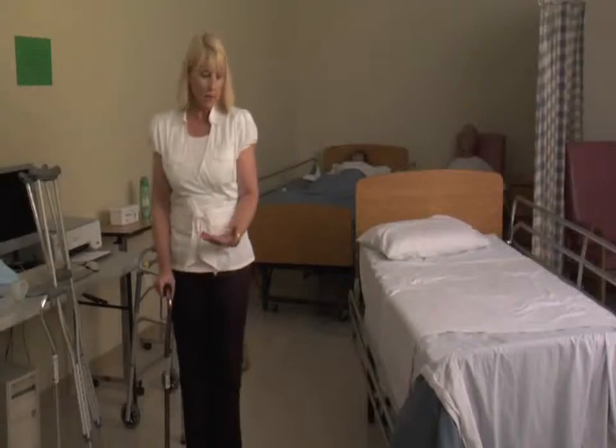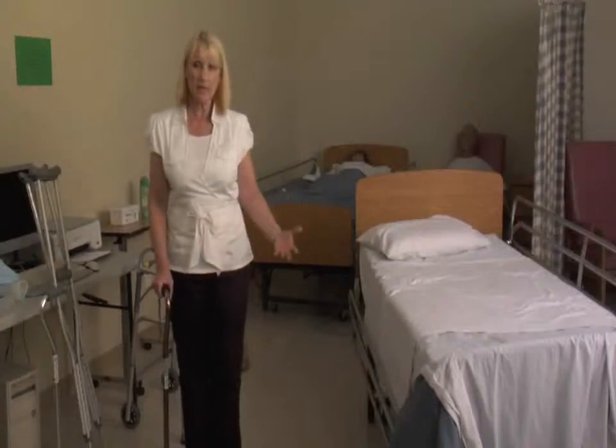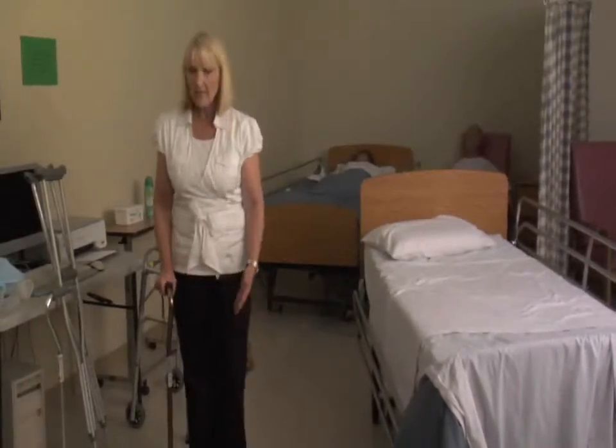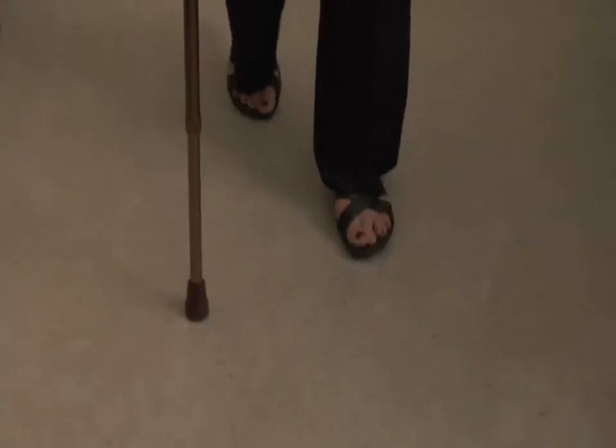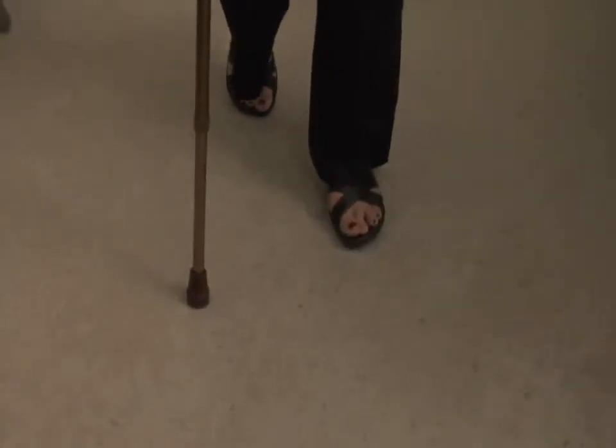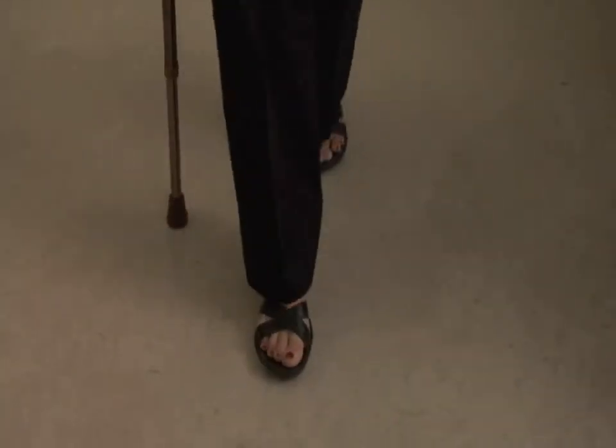So if somebody's helping me walk or ambulate, they would be standing on my weak side, and I've got my cane on the strong side. The cane and the weak leg go forward together. And then I can support myself with the cane. So cane and weak leg, and then I'm supporting myself.